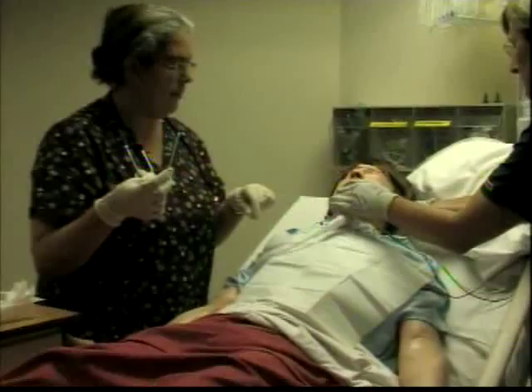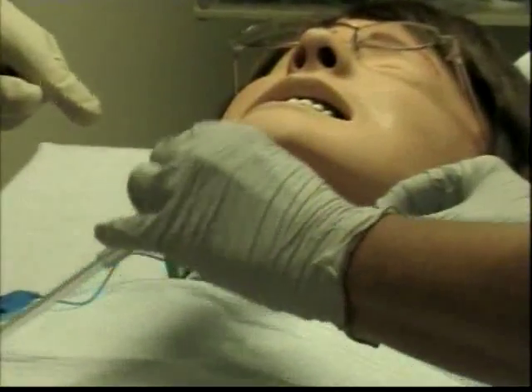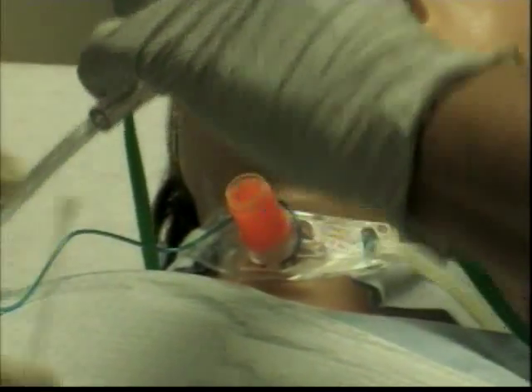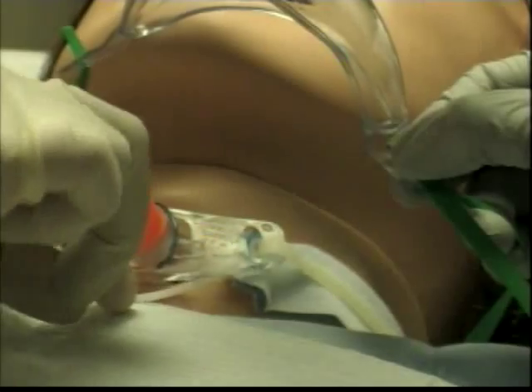So we can see your trach better. There we go. As she's maintaining the oxygen source available to her, I'm looking at all her vitals and everything in there, so I'll make sure that she's doing okay. I will hold the plate in place and do a sweep motion, cleaning all the crusties that are under there, and make sure we only use it once, and we keep it in here.